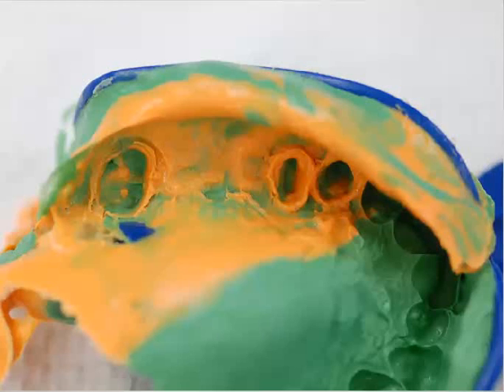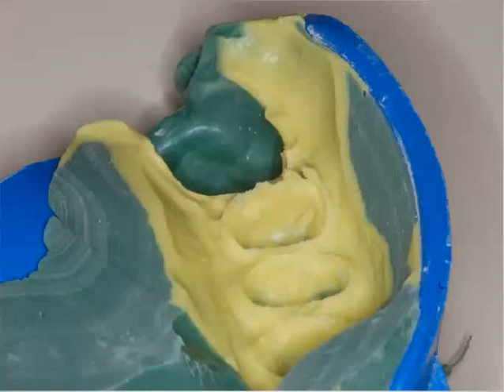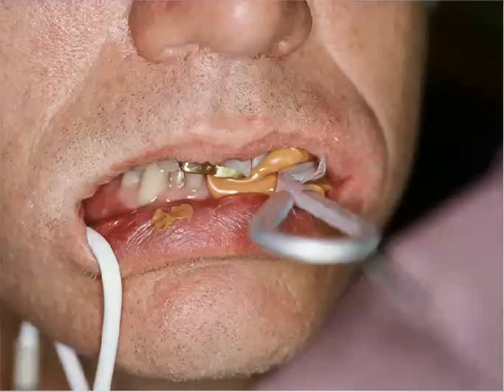We talk about larger cases and what's the best way to fabricate these restorations. We also have problems with torn margins, maybe tear strength, maybe inability to get the material subsulcular. We get relapse and collapse of the sulcular tissues. It becomes a real problem. It can pinch off the material, or we may have fluid or blood subgingival, which create problems of improper polymerization. That can become a problem down the road.